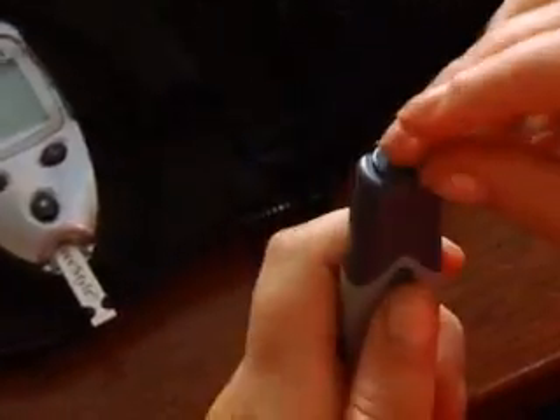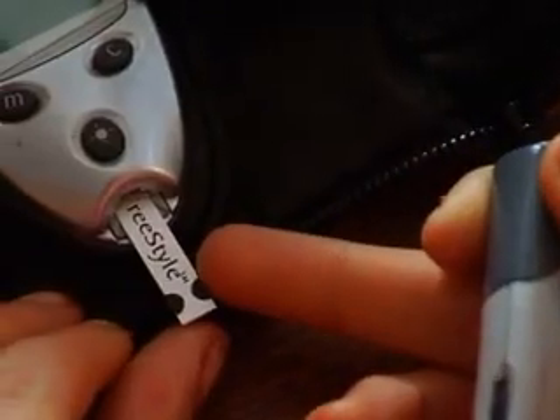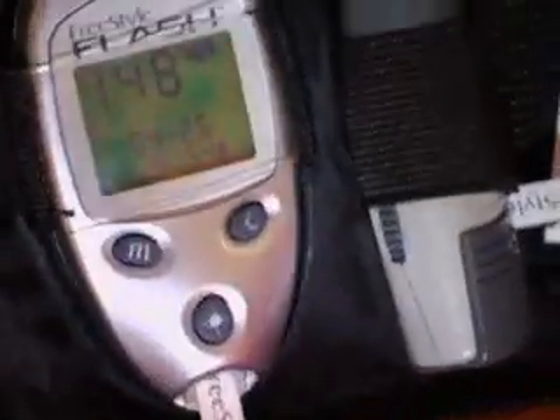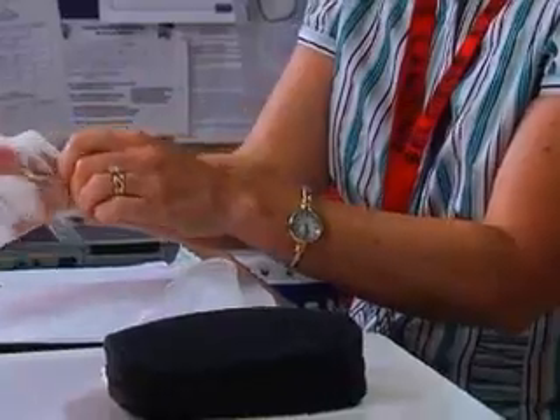Many students can monitor their own blood glucose. Monitoring means using a lancet device to prick the skin at the fingertip, forearm, or other site to obtain a drop of blood. The drop goes onto a strip that is inserted into a meter. The meter shows the blood glucose level. Some students may need a nurse or other trained staff to do the checking, or help the student check.